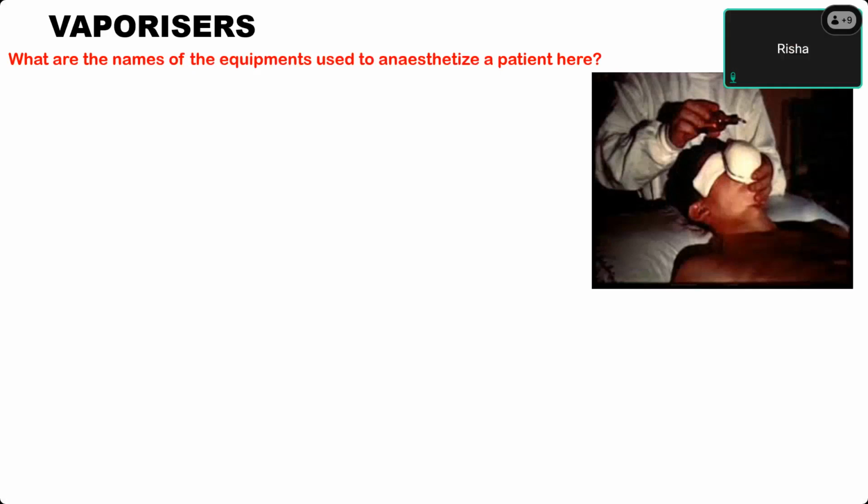It should be changed to a condensation form. It should become a vapor. It should have become vaporized and it should become a vapor, like a gas. So last class we saw what was the difference between a vapor and a gas. What is the difference between a vapor and a gas?